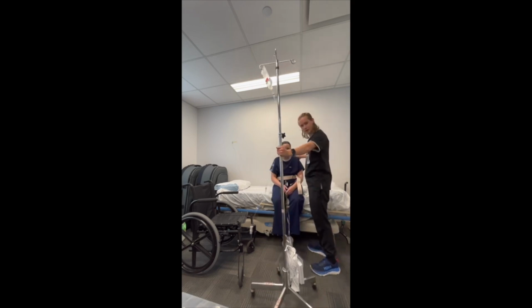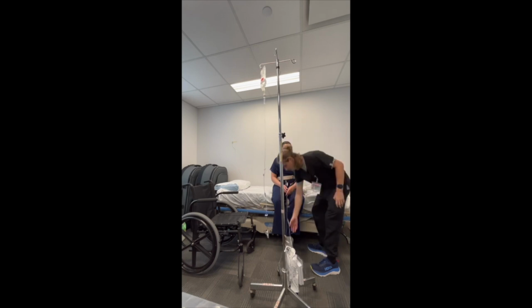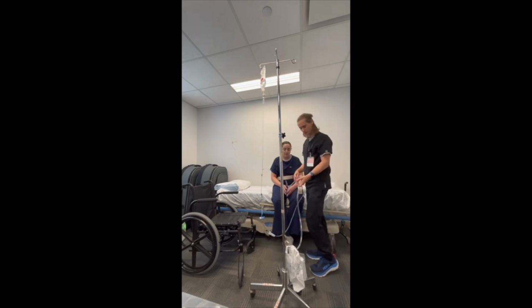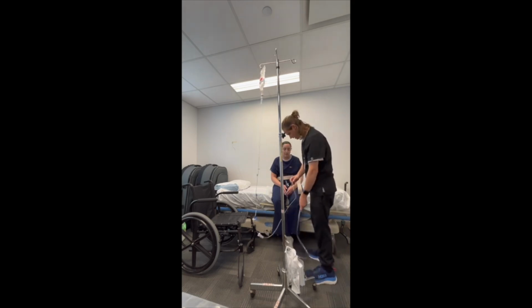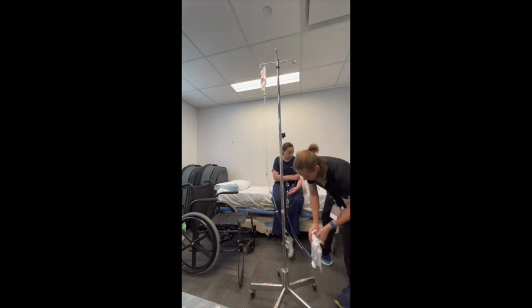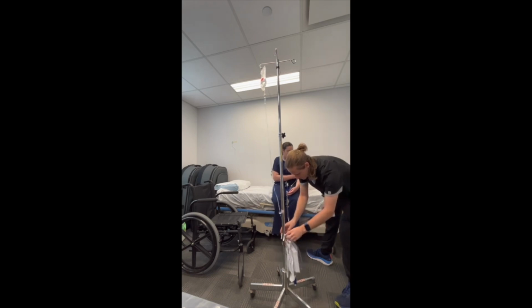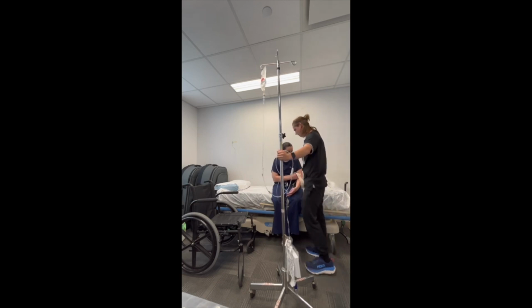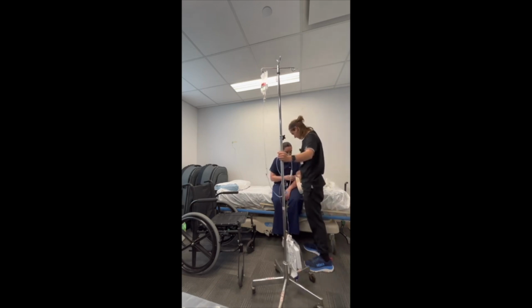Good. And so from there, we're now going to get up and perform our mobility, making sure that when we stand, there's not so much slack in these lines and tubes that it's going to drag on the floor and create a tripping hazard. So if you feel like that's going to happen, something you can do is hold it up along with this. And then if you do that with both of these. Good. And then are you ready to try and stand up? We're going to turn towards this shoulder and take a seat in that chair. Yep. Okay, let's do it.